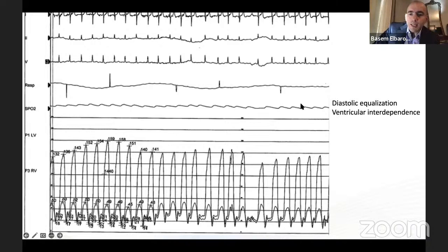So yeah, the mixed venous oxygen can be measured directly from the tip of the Swan in the pulmonary artery, because the blood has been mixed up and sent up there. But if you're trying to measure it in the right atrium, where are you measuring it? Are you going to measure it high, closer to the SVC, low, closer to the IVC, in the middle where the shunt is?